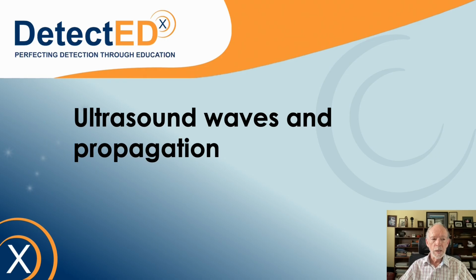For example, a loudspeaker will compress and then decompress the air in an oscillating fashion. This will create sound waves which will travel through the air, reach our ear and set the eardrum vibrating, which we then experience as sound. Ultrasound is exactly the same, except that it operates at much higher frequencies. And of course it's traveling through tissues rather than through the air.